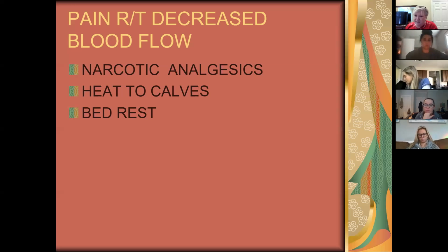Now, please understand, it would take a pretty good bunch of oxygen to make them stop breathing. But that's why they say you can use 2 liters. 2 is not going to knock anybody's breath out. So you can start 2 liters, and then you would call the physician and say, we had to start oxygen on Mr. Smith. And if 2 liters didn't help him, then we would go up some more.